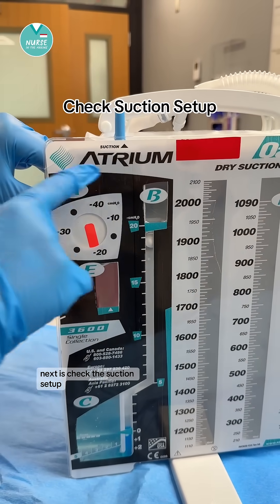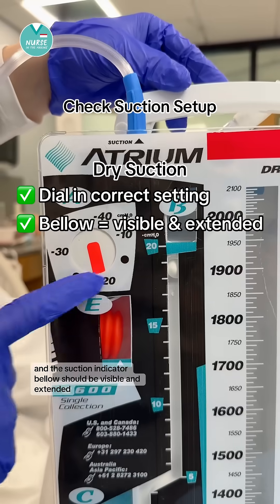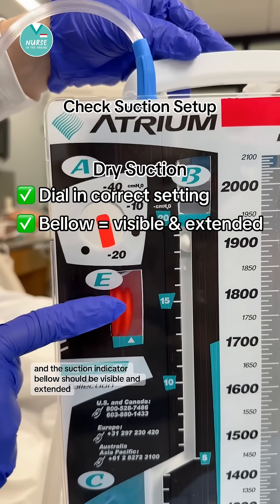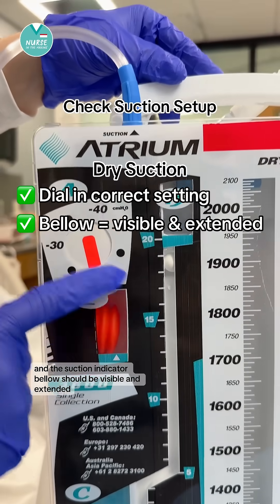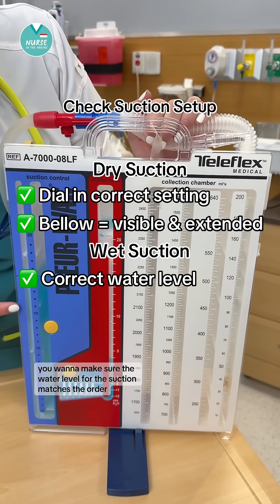Next, check the suction setup. In a dry system, you want to check the suction dial and the suction indicator bellow should be visible and extended. In a wet system, you want to make sure the water level for the suction matches the order.